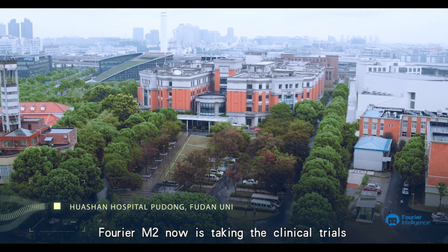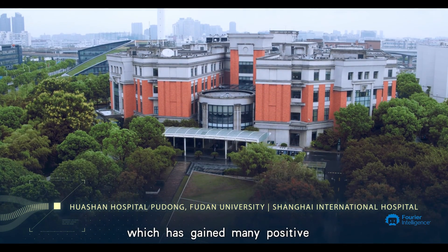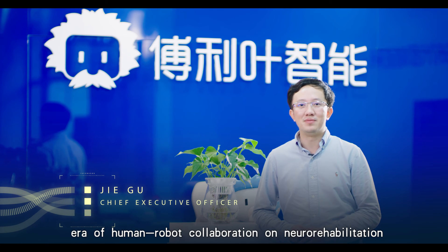Fourier M2 is now undergoing clinical trials in many hospitals in China, which has gained many positive feedbacks from both patients and therapists. We hope that Fourier M2, a robot with the sense of touch, will open a door of human-robot collaboration for rehabilitation.